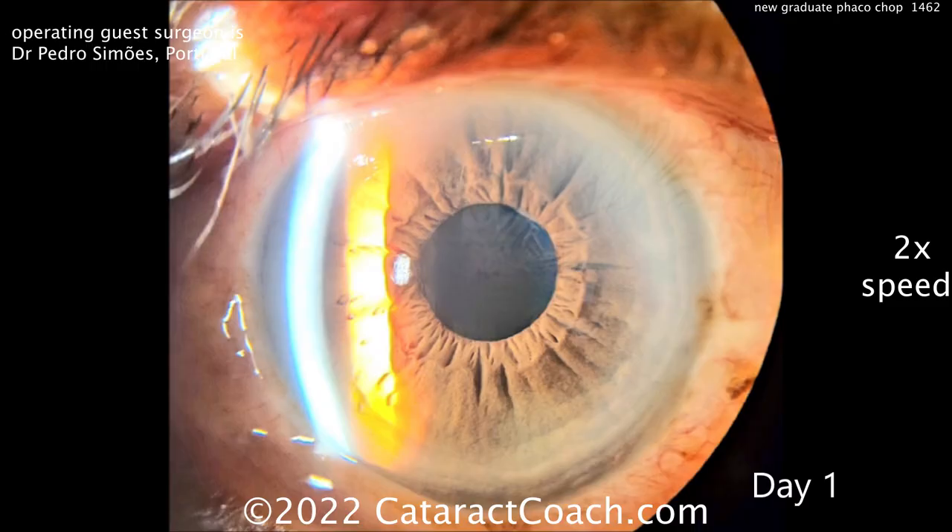Thanks for sending the video in — and send your video in too. Here's post-op day one for this patient. Immediately on day one: nice looking, clear cornea, lens in good position, and a happy patient. So if you want to learn Faco Chop, do it. I'm going to have a whole series coming up — a curated playlist to teach you, to take you from Divide and Conquer to Faco Chop by watching and learning from 10 or 12 videos in a row. The curated playlists are coming up in the very near future.